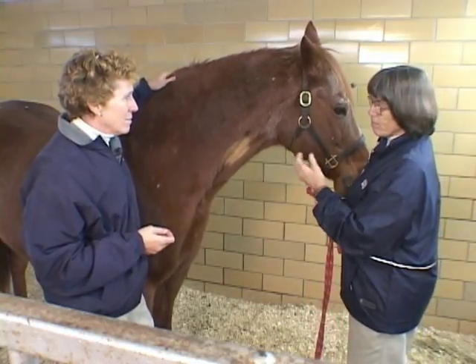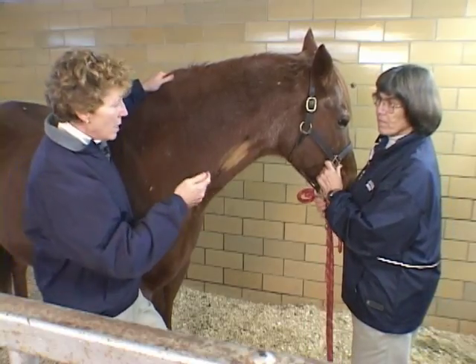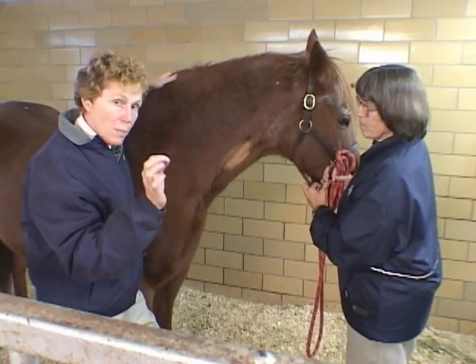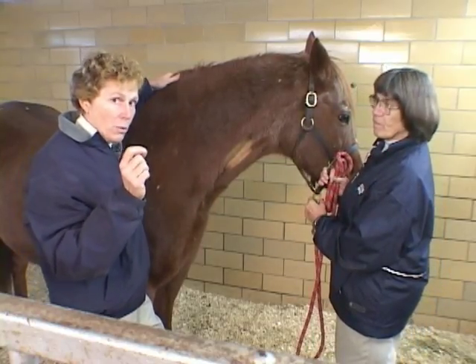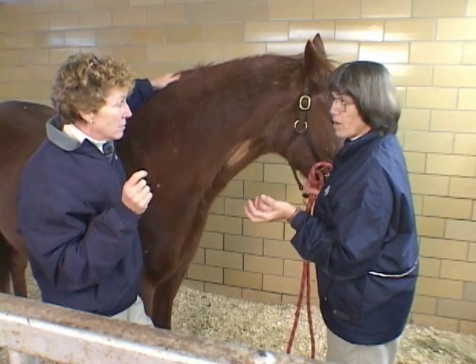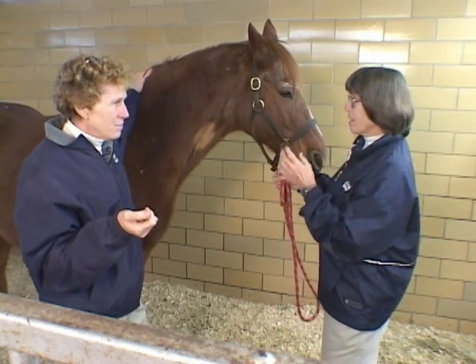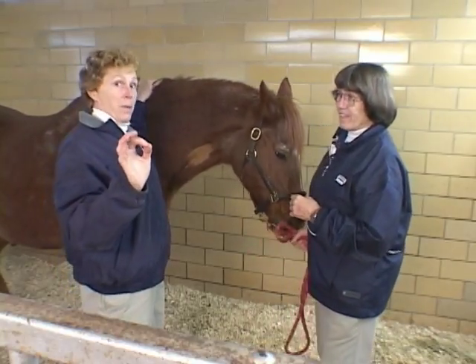Why is it important to take that needle off the syringe when doing the injection, and what do you look for? The reason is I want to be sure I'm in the jugular. The carotid runs deep to the jugular here in the jugular groove — it's behind it, deep inside the horse. So if I got unlucky and stuck my needle all the way through the jugular and ended up in the carotid, arteries are different than veins and I'll get that rhythmic spurt, spurt, spurt, giving me a clue I've made a mistake and need to back out and put myself back into the jugular vein. People talk about arterial blood being redder than venous blood, but with poor lighting it can be hard to tell. You really want to look at the flow — the blood came very slowly out of the needle for the vein, but if you were in an artery, it would be coming fast and would squirt you in the eye.